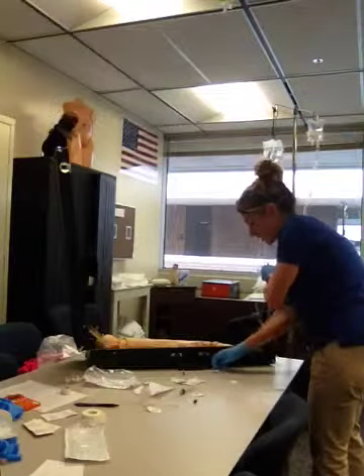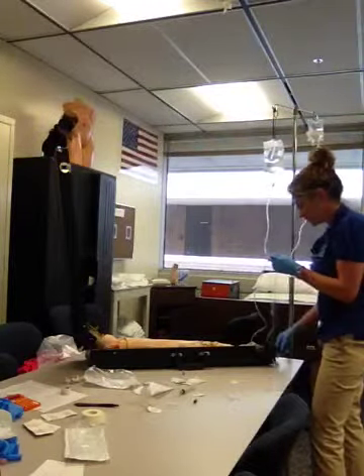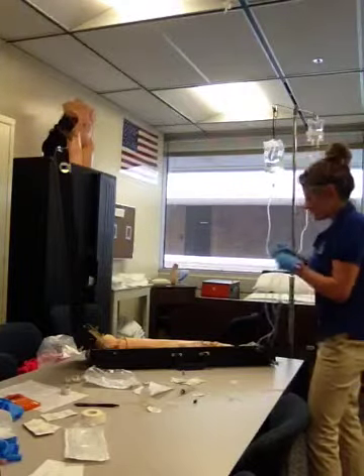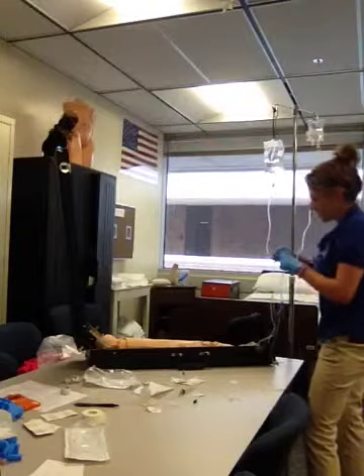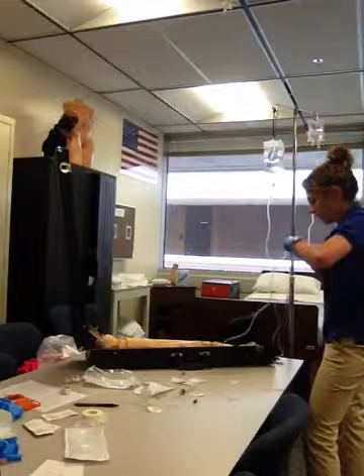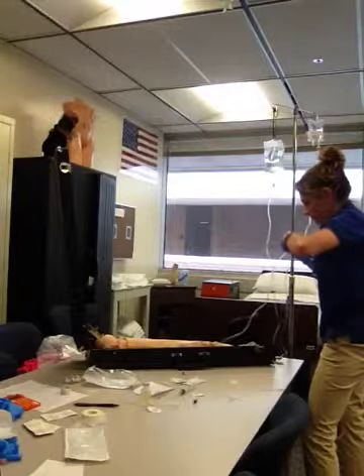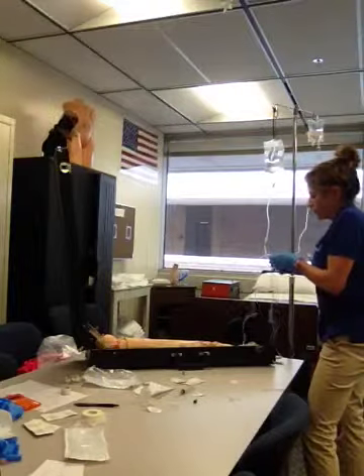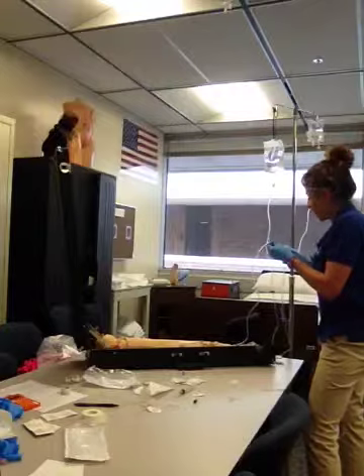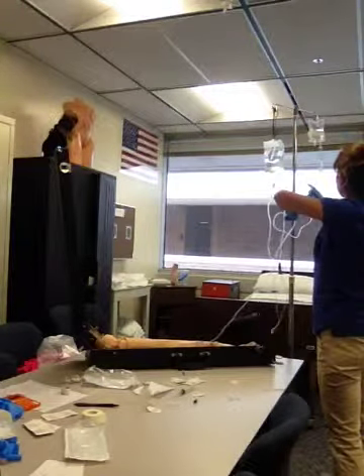And I'm going to clean the port, and I'm going to open and I'm going to count.